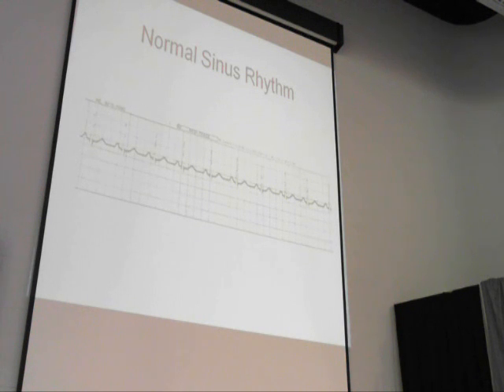You also want the rate. That's really important, especially when we get into the abnormal things. And we want an atrial rate and a ventricular rate when we're looking at the rhythms and dysrhythmias. What do we mean by atrial and ventricular? What are we going to assess? When I tell you to look at the P waves on the patient's monitor strip, what are we assessing?